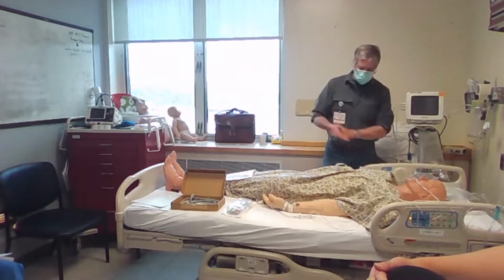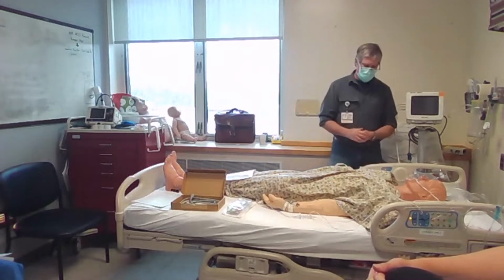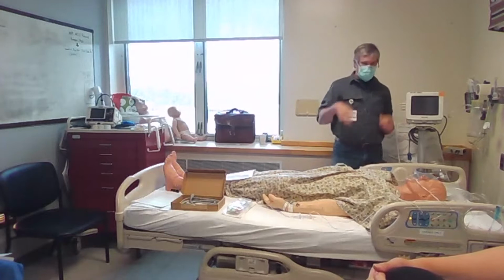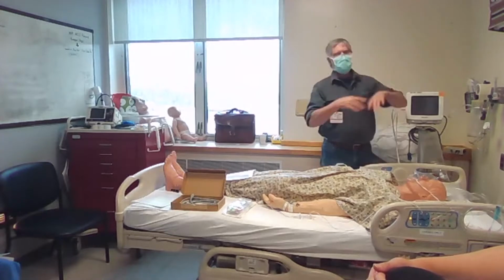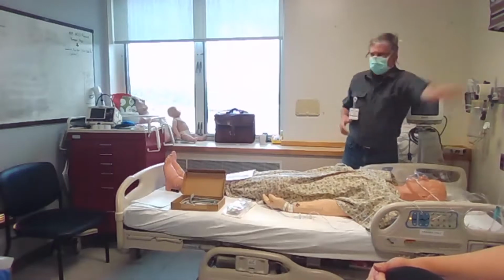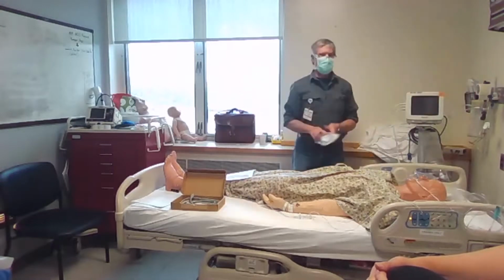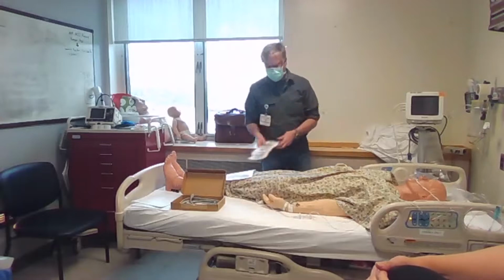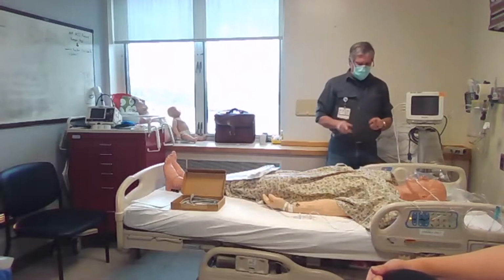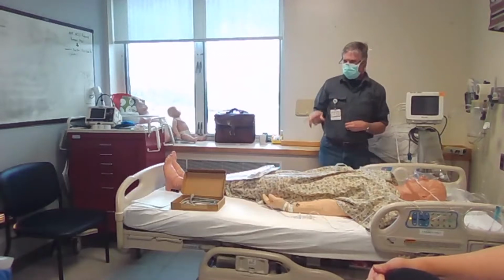So there's the catheter. There's the transducer, which is the next thing we'll talk about in a few minutes. And then there is the display, which is going to be what you're looking at. And you can consider, we're talking about the transducer here, but consider this all one package, which is right here. And I can open this, right? Yep. And we'll go through it.